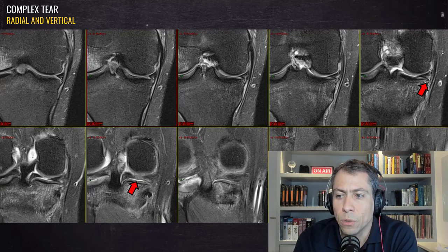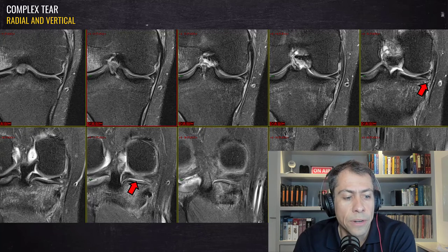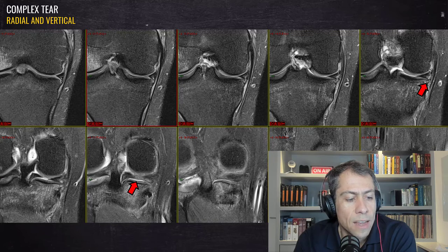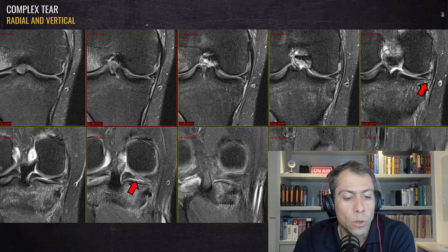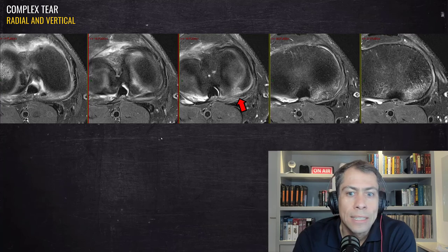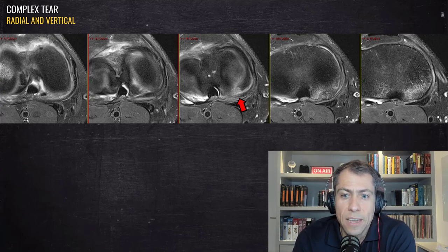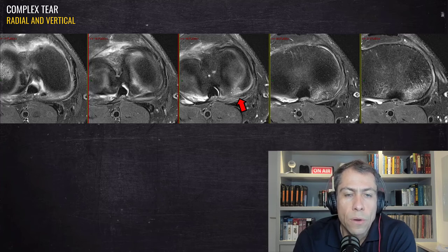On the coronal plane we can appreciate that the vertical longitudinal tear goes further anteriorly into the meniscal body, and here in the area of the posterior horn of the medial meniscus we can see a partial cleft sign caused by the partial radial tear. The meniscus is blurred in the region of transition between the radial tear and the periphery of the meniscus. On the axial plane — which is amazing for seeing this complex tear — we can clearly see the longitudinal vertical tear and the radial partial tear.